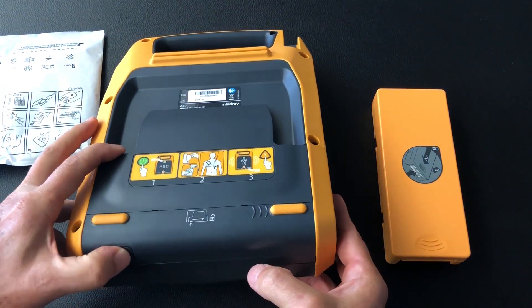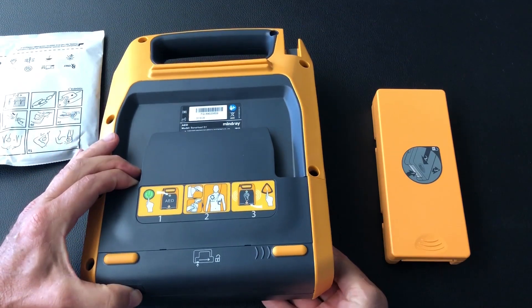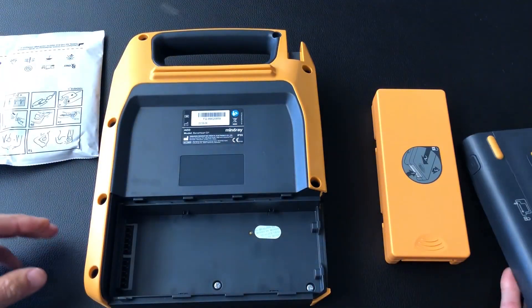That is done by pressing in this little button on the bottom and pushing over to the right — and there we have it, it's come off.